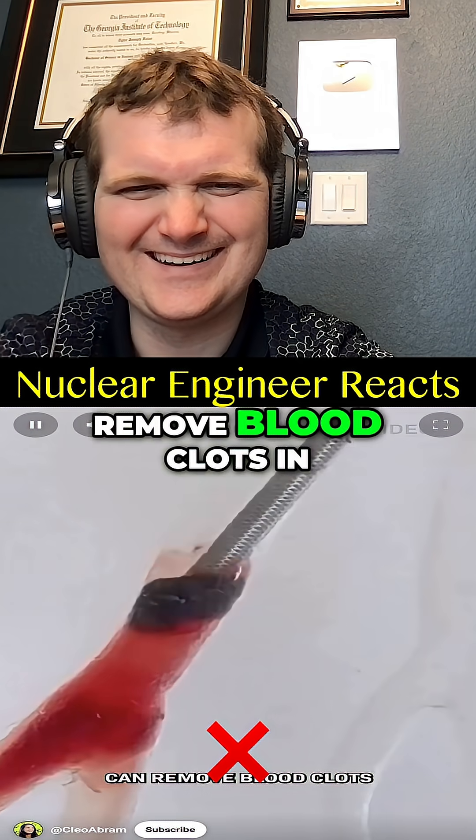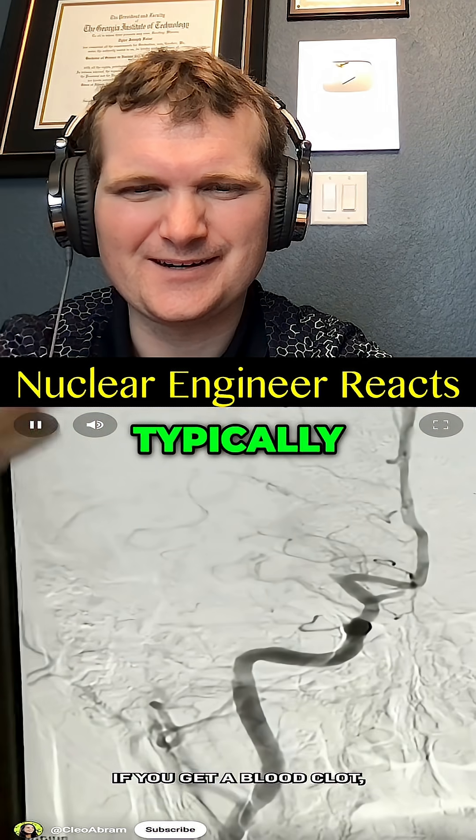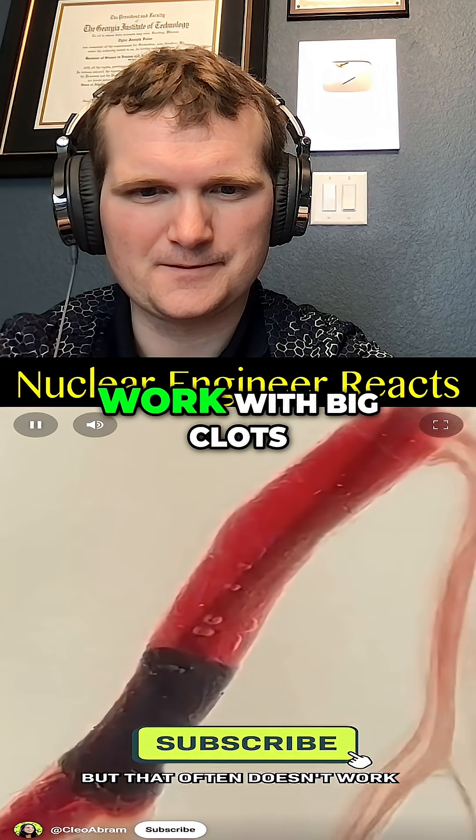Look at this. This new device can remove blood clots in a totally new way, and that could save your life. Here's how. Typically, if you get a blood clot, your doctors could remove it by sucking it out like this, or dragging it out like this. But that often doesn't work with big clots.